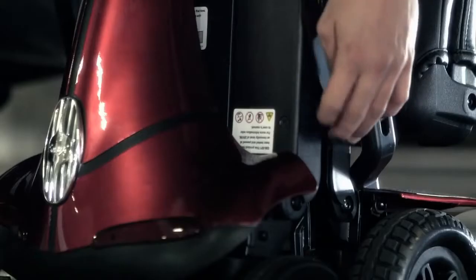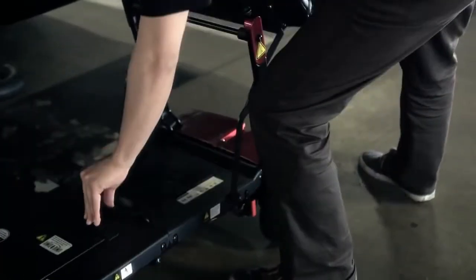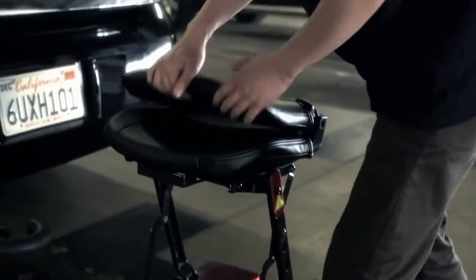First you unlock the Mobi, then you unfold it, then you adjust the tiller to fit your comfort.